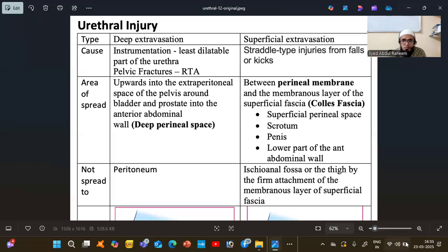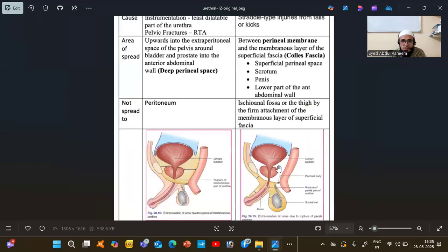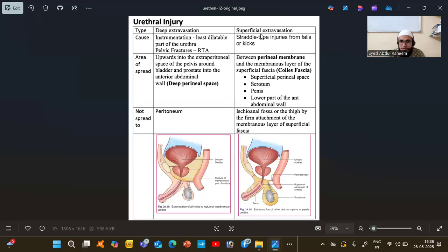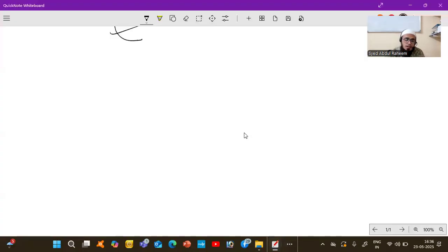Next we have superficial injury, and this is a very deep injury. This is rupture. This is deep injury, which leads to breakdown of the connection. So these are very problematic things. Sometimes surgical intervention is needed, and sometimes it can be treated.